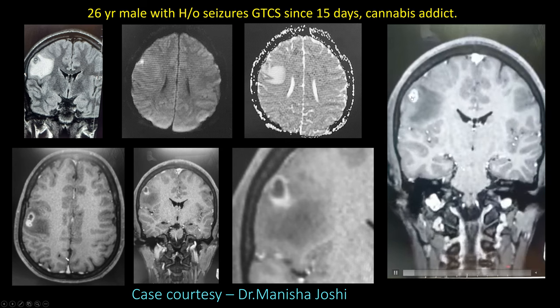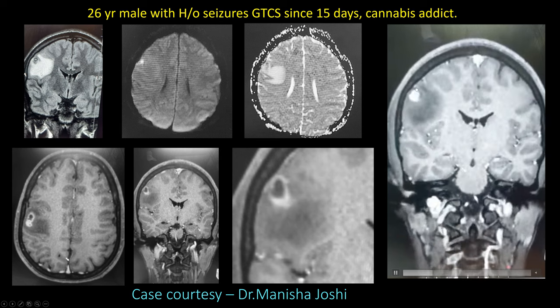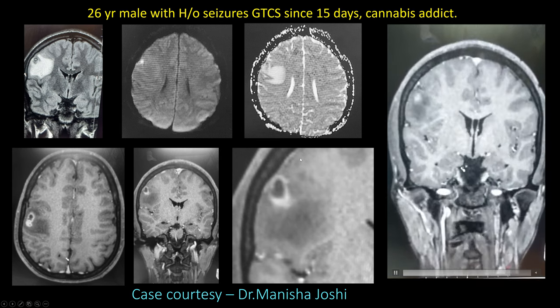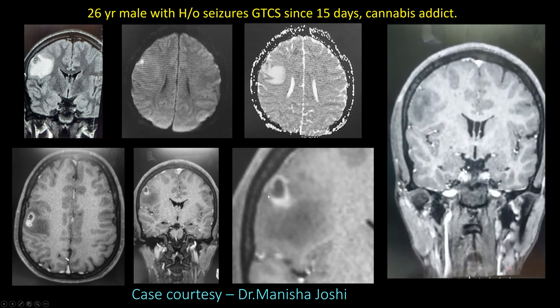On IV contrast, you can see the conglomerate ring enhancing lesions. There is a typical perilesional contrast leakage seen around the lesion. This perilesional contrast leakage is the teaching point here — it is specific for NCC (neurocysticercosis) rather than tuberculomas.